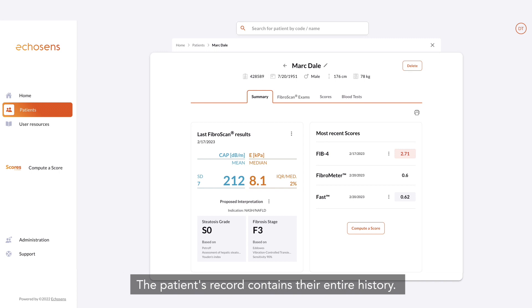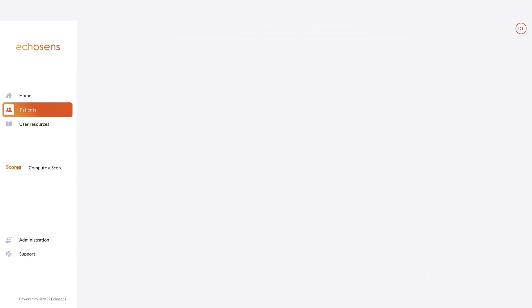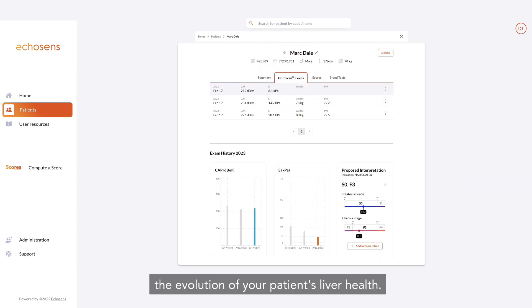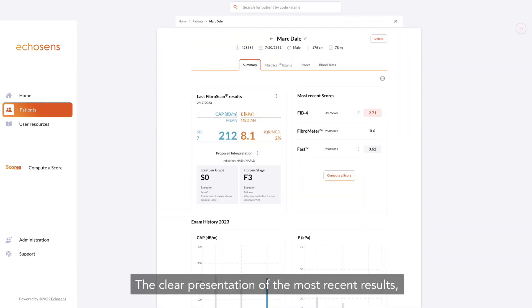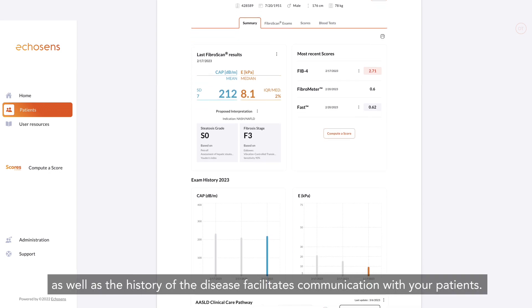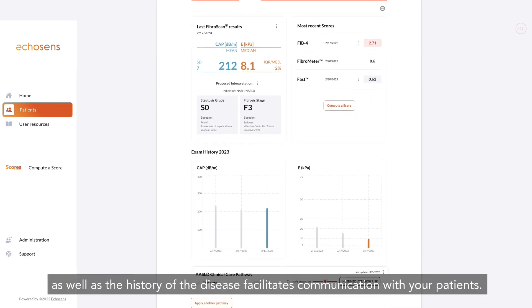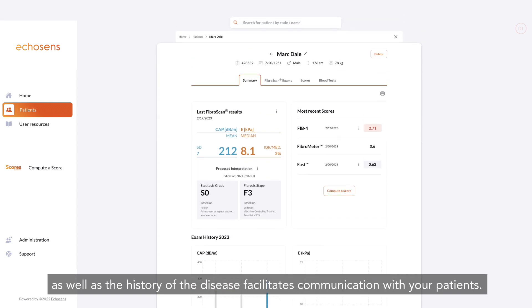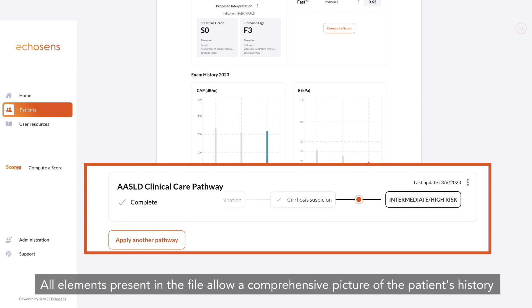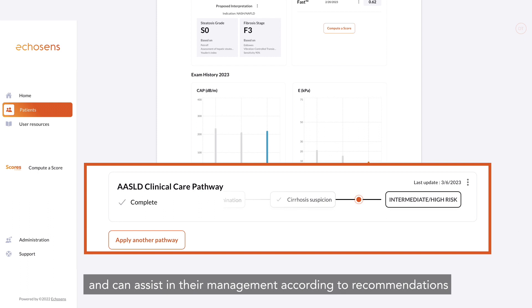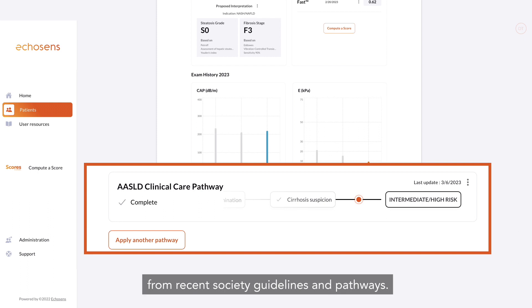The patient's record contains their entire history. The FibroScan exams tab allows you to follow the evolution of your patient's liver health. Calculated scores and blood tests recorded are also present in the file. The clear presentation of the most recent results, as well as the history of the disease, facilitates communication with your patients. The summary page can be printed, and all elements in the file allow a comprehensive picture of the patient's history to assist in their management according to recent society guidelines and pathways.